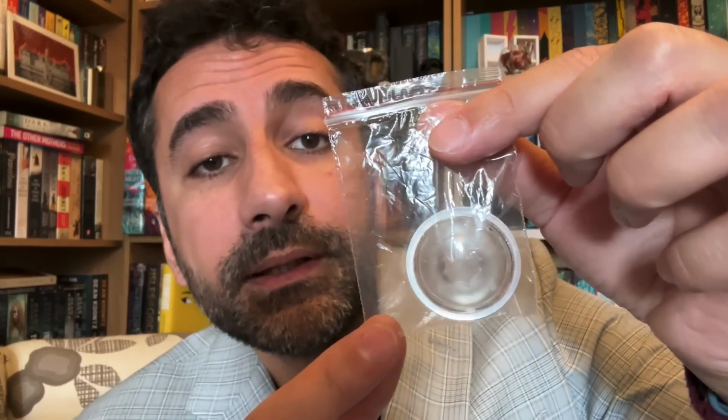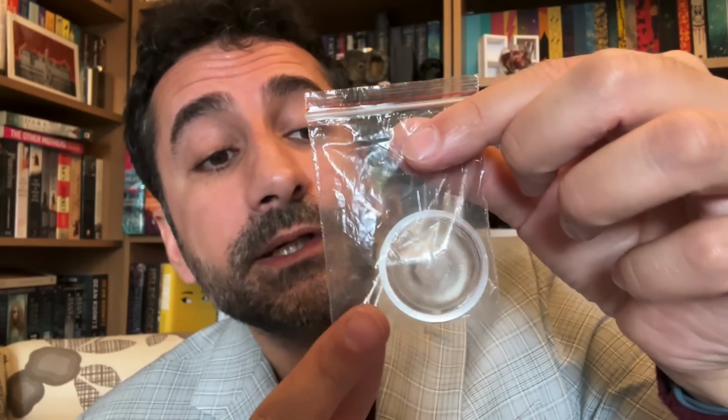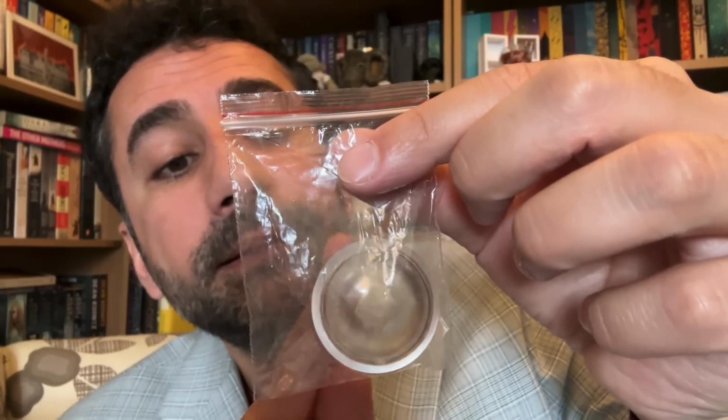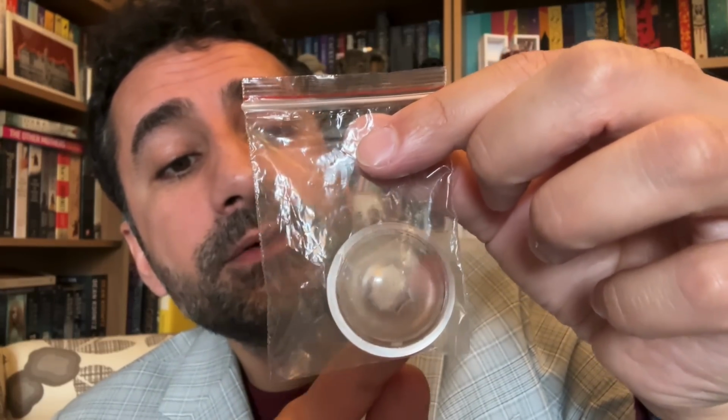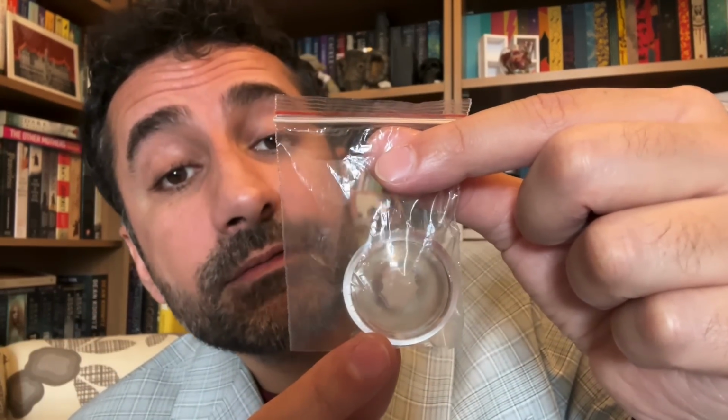Okay, number 6. We're going to try a couple of tricky ones. Within the crinkly packaging here is a type of cataract, where you can see the middle is spared and the cataract itself is starting to come through the lens from the edge.